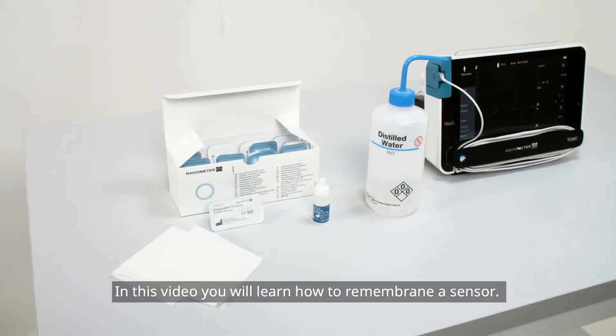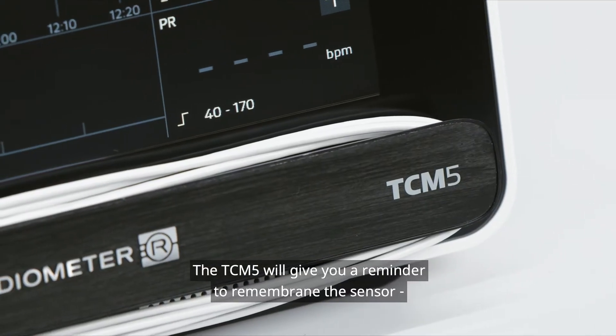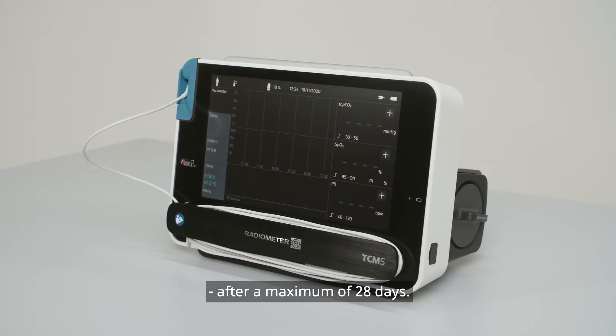In this video, you will learn how to re-membrane a sensor. The TCM-5 will give you a reminder to re-membrane the sensor after a maximum of 28 days.